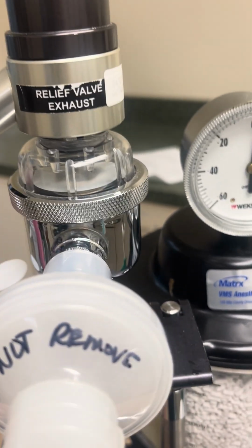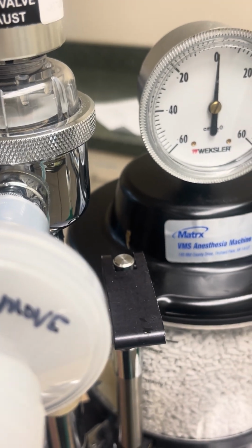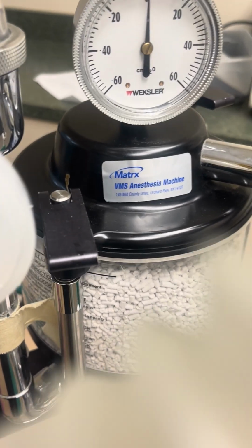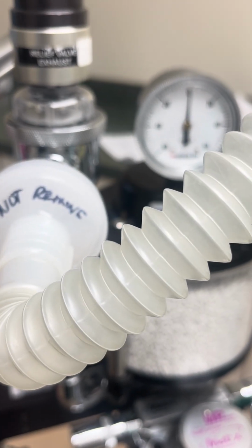This prevents backflow of gas to the patient, so they don't have to breathe in the exhaled gas. It pulls air towards the machine and exits and recycles air either via the pop-off valve, CO2 canister, or at the scavenge, and helps direct proper gas flow away from the patient via flutter or disc.